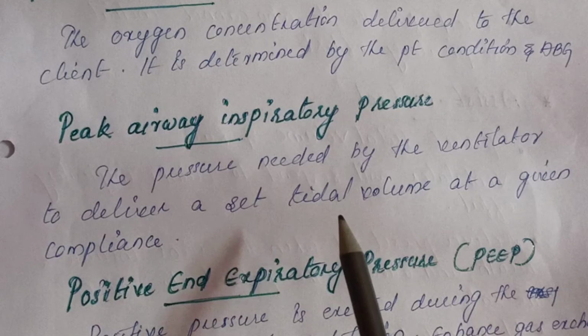Now let us see the modes of the ventilator briefly. We have four main modes for ventilation, that is control mode, assist control, SIMV or synchronized intermittent mandatory ventilation.